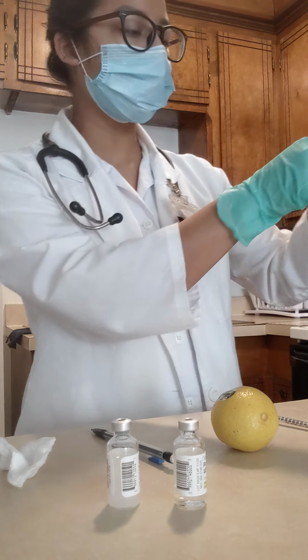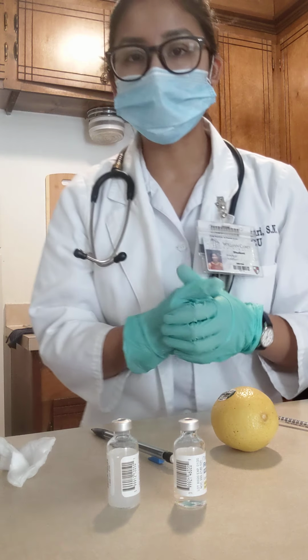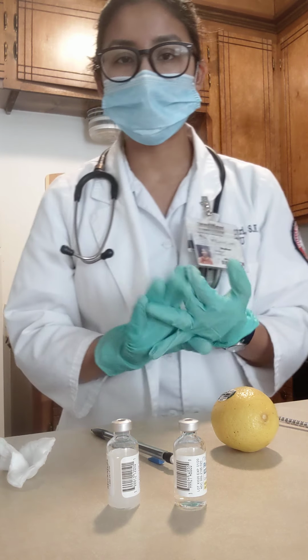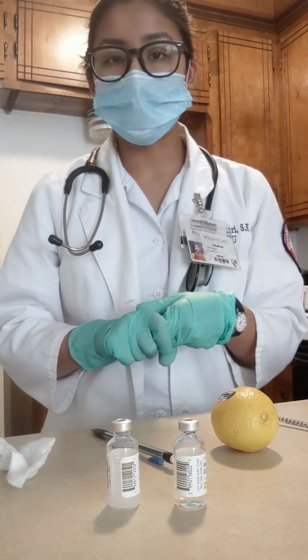I'm going to put on some clean gloves and do a focused assessment on my patient. The patient's blood glucose level was 252 mg per dL. The patient has signs of hyperglycemia: polydipsia, dry mouth, polyuria, and a fruity smell of breath.